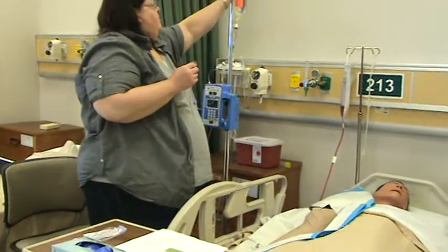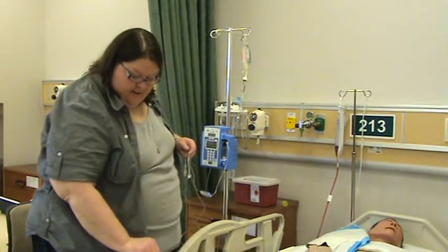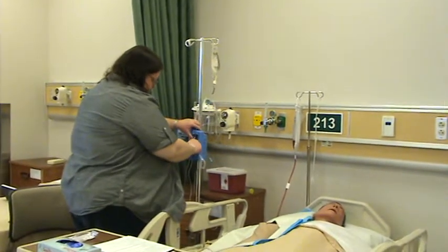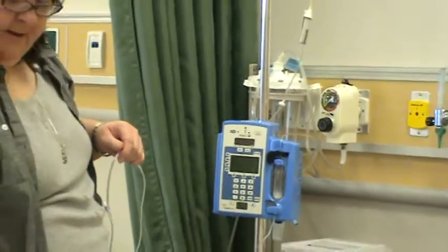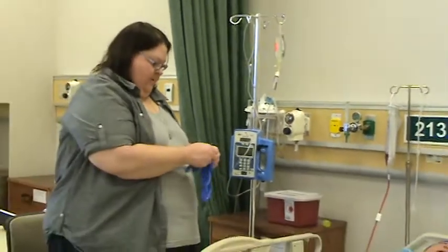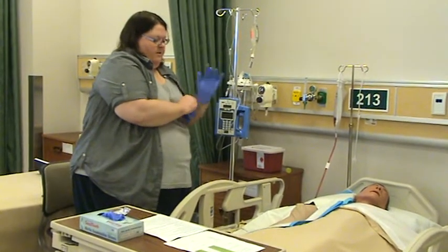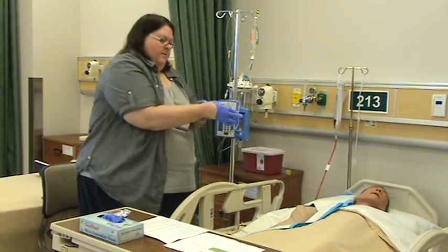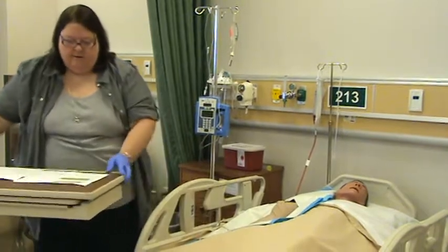I'm going to hang this up, Mr. Pooh. I'm going to put the cassette in and close the latch, then put gloves on.